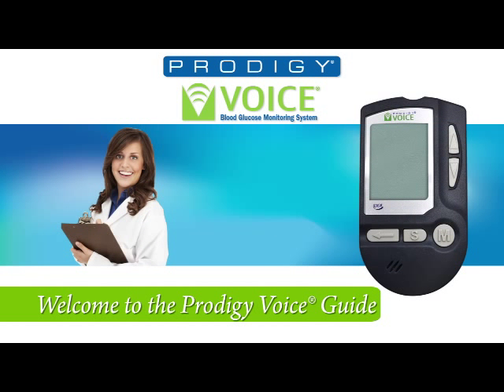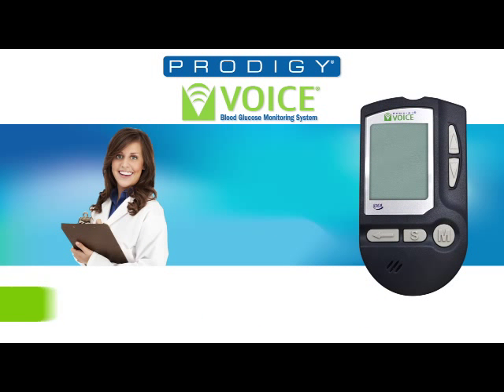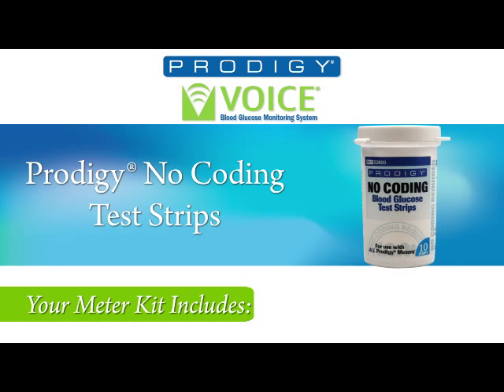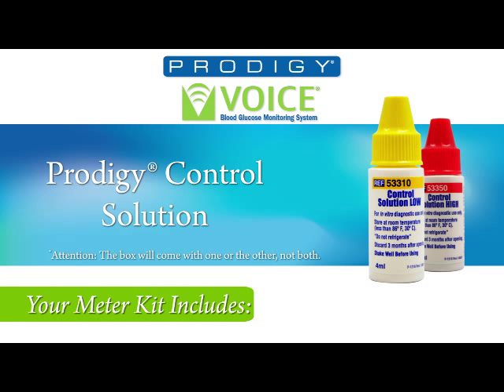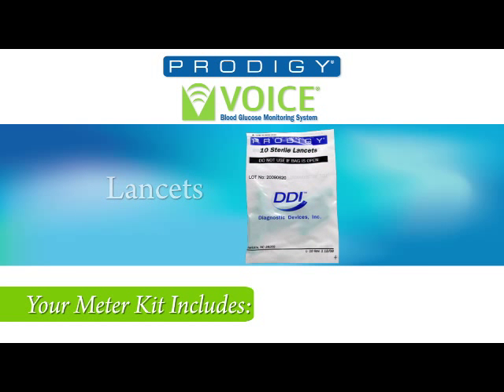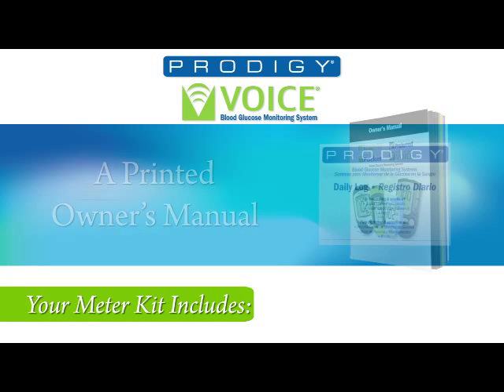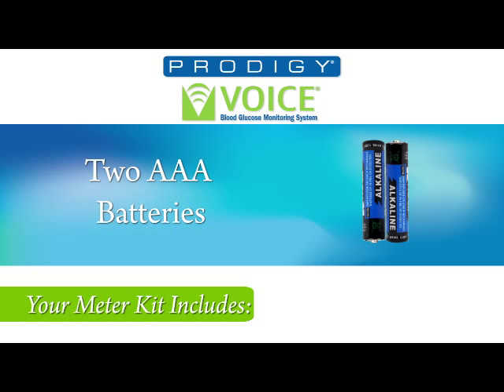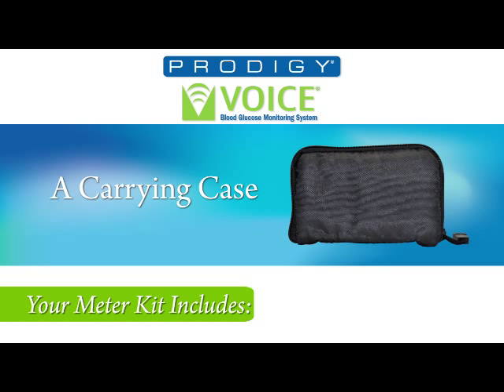Welcome to the Prodigy Voice Meter. Upon opening the box, you'll find inside: the Prodigy Voice Meter, Prodigy No-Coding Test Strips, Prodigy Control Solution, a lancing device, lancets, a printed owner's manual, logbook, warranty card, two AAA alkaline batteries, and a carrying case.